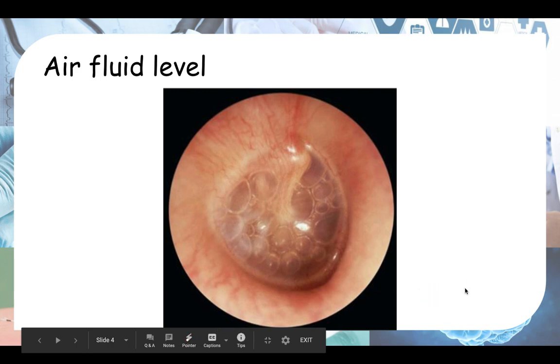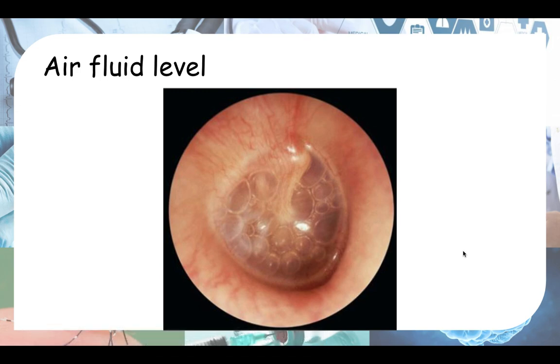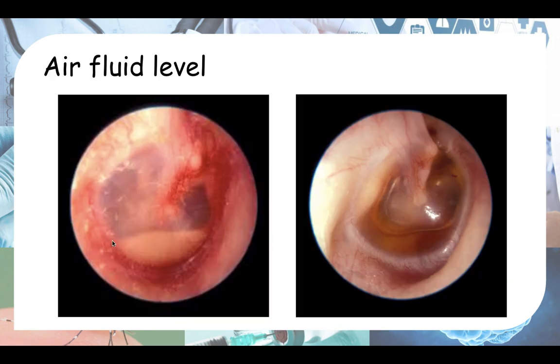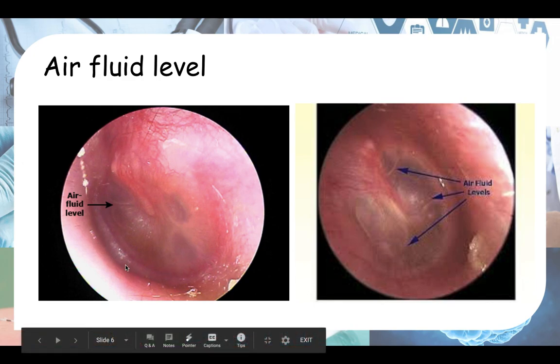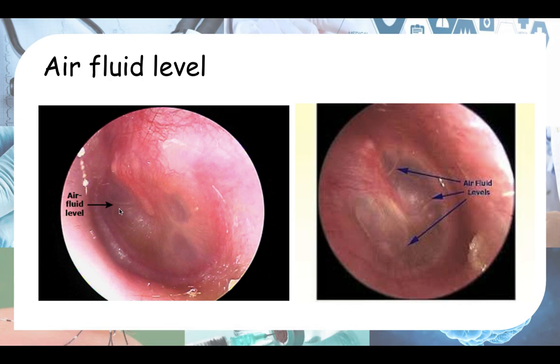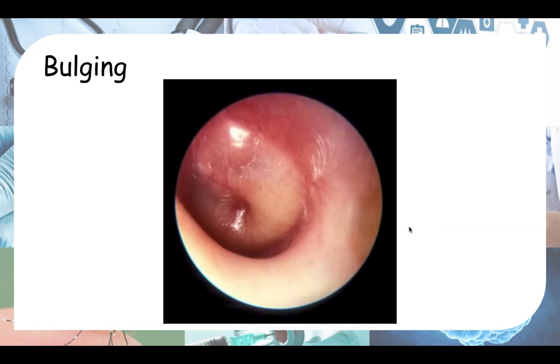Next, we'll be talking about the air fluid level. Sometimes it is very obvious — like in this picture you can see bubbles inside. Sometimes you see a purulent air fluid level, and sometimes it's a clear serous air fluid level. But most of the time you don't see it so clearly, so you have to look carefully at the eardrum. Here you can see one air fluid level, and over here you can see a few air fluid levels, but they're not that obvious.